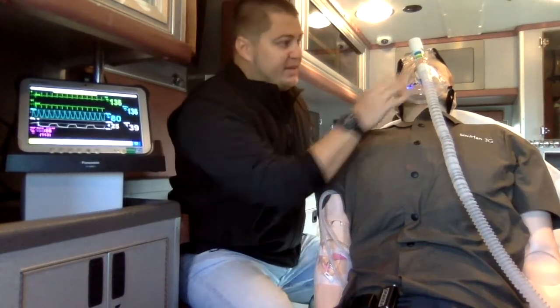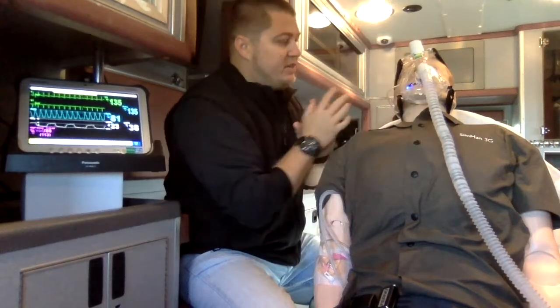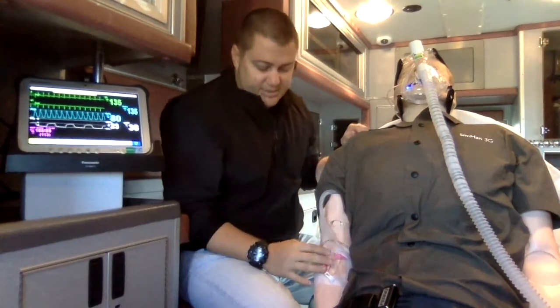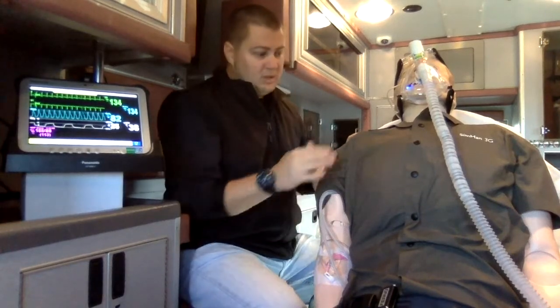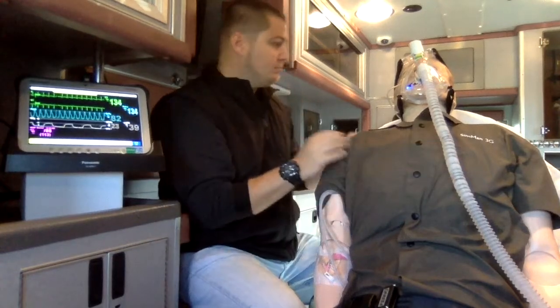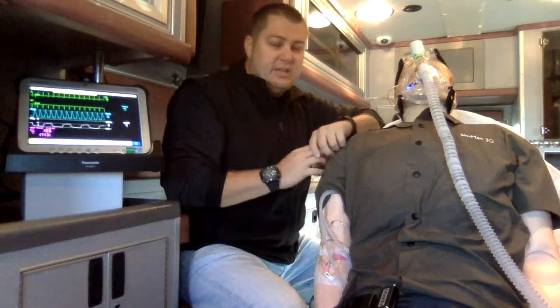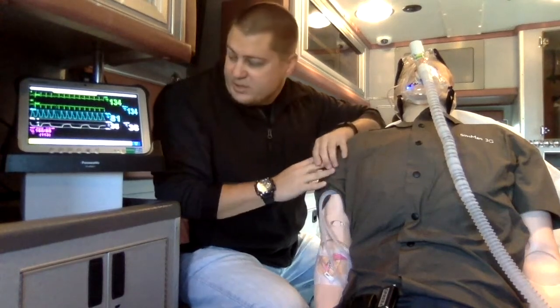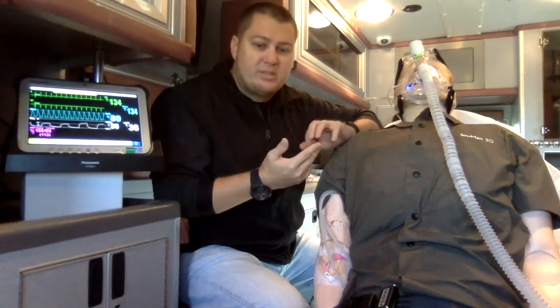So CPAP's in place. I got a PEEP setting originally of 5. I'm going to increase that to 7.5 and see if I have any changes. I'm also going to establish an IV for IV access. Listen to lung sounds again, still the same, still diminished throughout. The patient does have some slight relief with CPAP being placed. I do see a slight decrease in heart rate, a slight increase in SpO2, which both are expected.